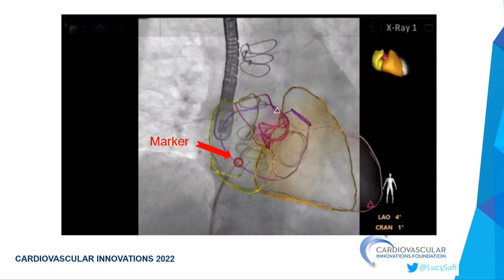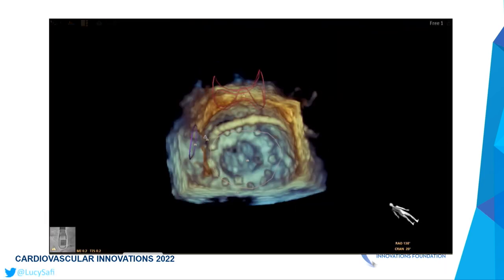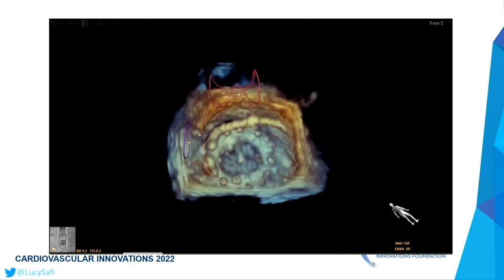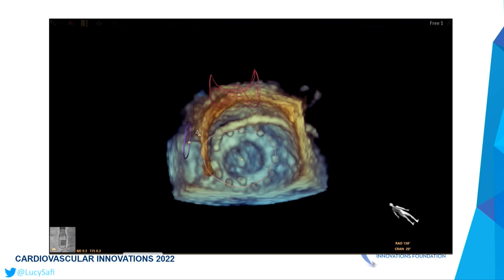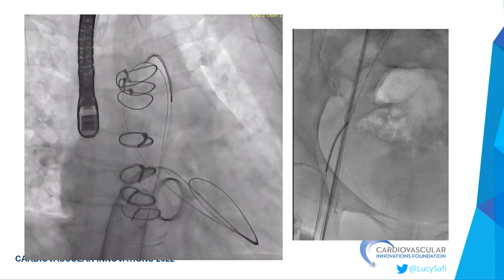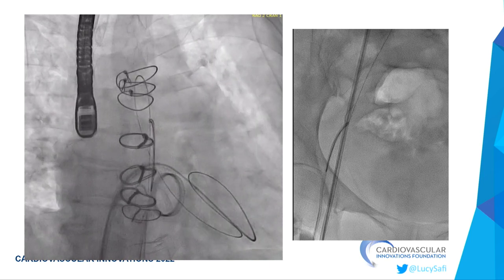And so our transseptal puncture site was marked for the interventional fellows. They're pretty spoiled. They have access to echo fusion, and they find it incredibly helpful with these transseptal punctures. Here you can see that the catheter is directed right into where the paravalvular leak was on previous imaging. You can see that the aortic valve is at 12 here. And we went ahead to create our rail, so you can see that the wire is in, looped through the left ventricle up, and then being snared now to being externalized.